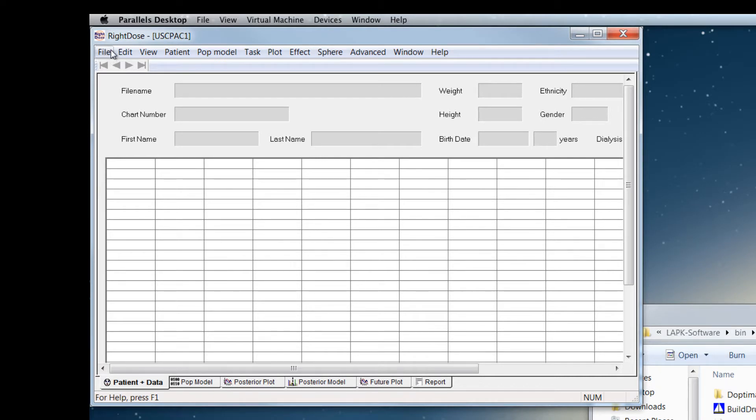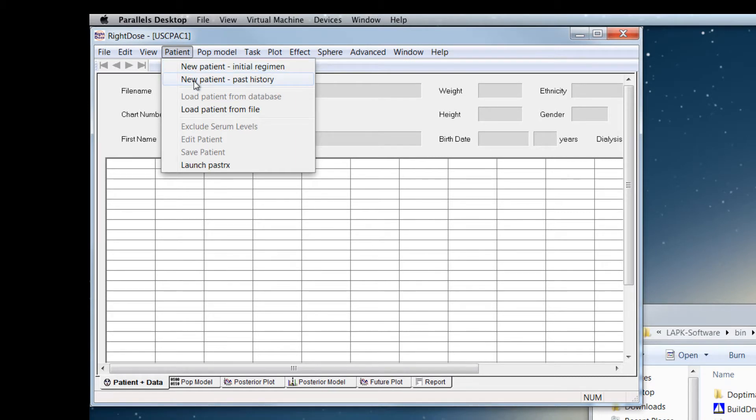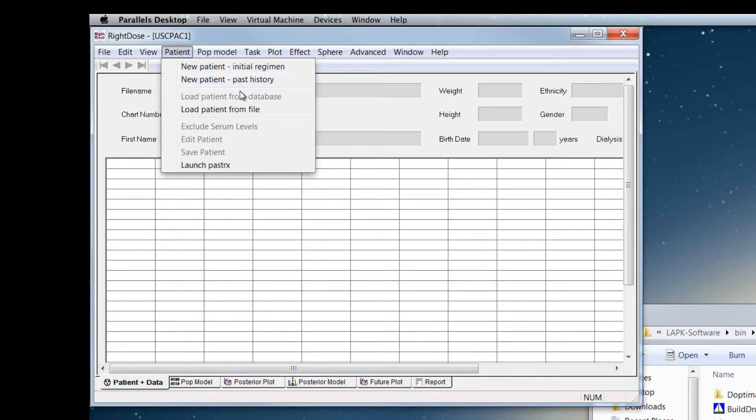So the main menu items that you'll use are the patient. You can plan an initial regimen for a new patient who has not received a drug before. If you have previously saved a patient file containing information about the past history, drug doses, drug concentrations, weights, etc., on a patient, you can create one here or load a file that's previously been made with this menu item here.